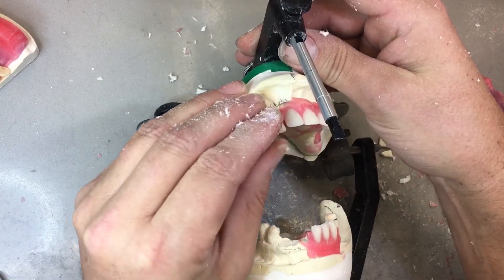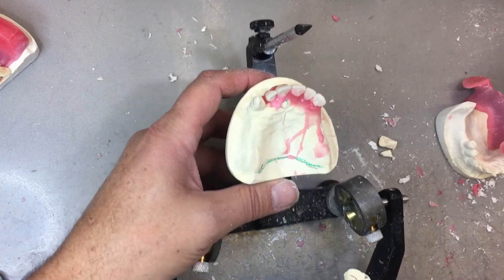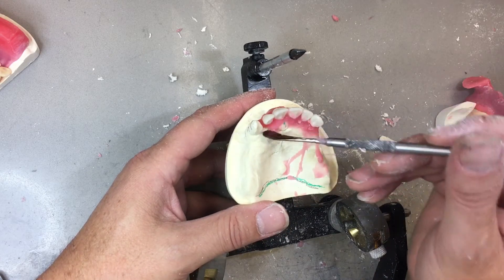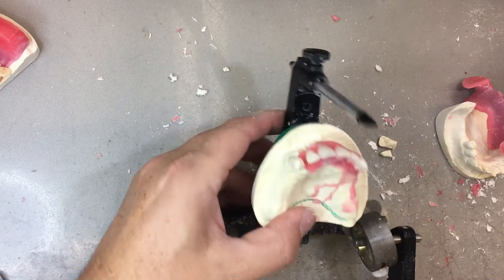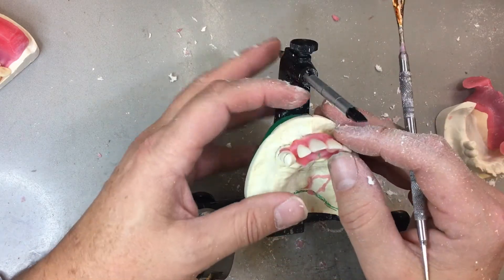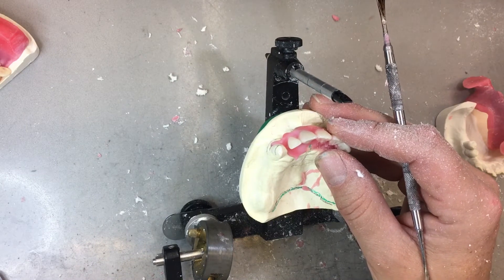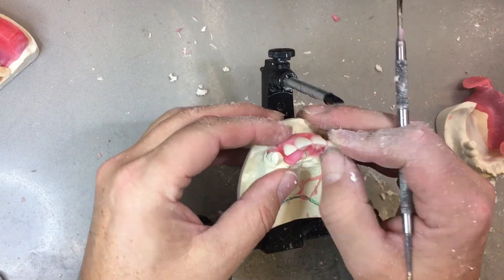I'm not there yet, but there will be a post-dam naturally. While I'm setting up the teeth here, let's talk about the post-dam. What's the reason for the post-dam? Do you remember the philosophies we talked about in the last couple of weeks? Whose philosophy was altering the model with a post-dam? He also created suction cups in the denture. So we're adopting a lot of things from all the denture philosophies. Keep in mind, those philosophies were created before cross-linked monomers, before injection systems, when there was more shrinkage in the PMMA. So the post-dam was put in to compensate for the shrinkage of the acrylic, and also to ensure a positive seat between the junction of the hard and soft palate.